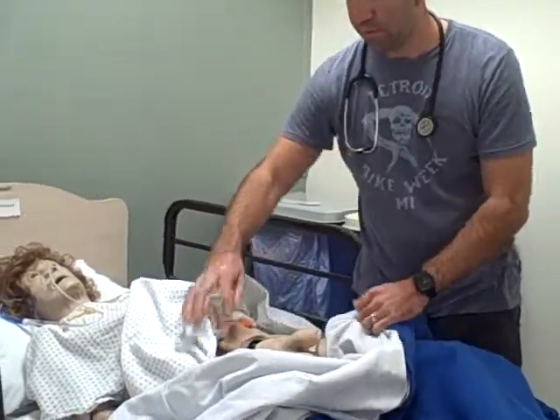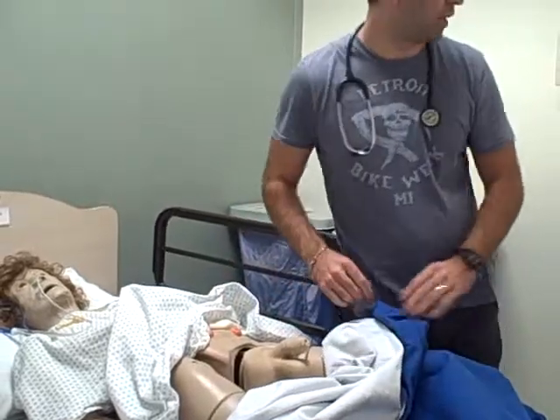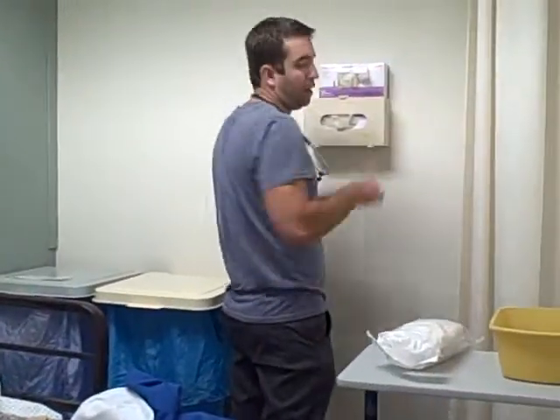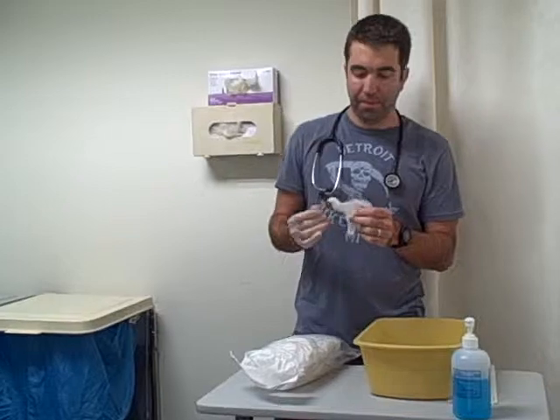The first thing I want to do is just to get ready. I'm going to put on some gloves. Oh, and I also want to make sure that there is a medical order to do the straight catheter. Can't do it without that.